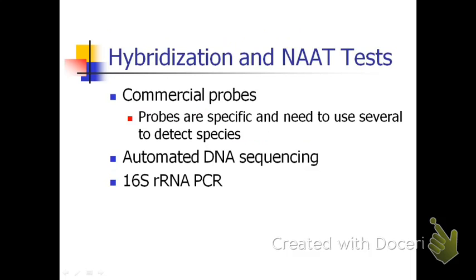Hybridization and the NAAT test. So, it's a commercial probe. This one is not anymore for phenotypic characterization, but for genotypic characterization. And this is not being done routinely, usually for research purposes.